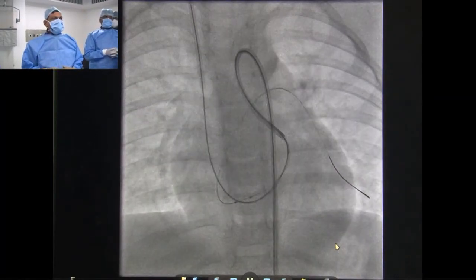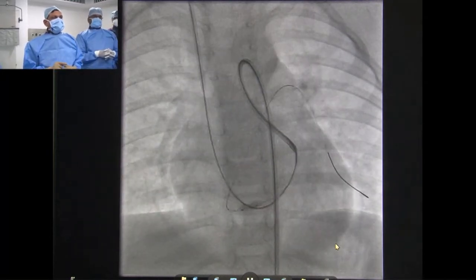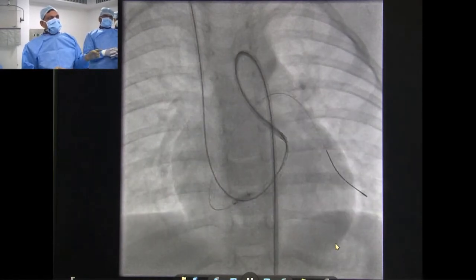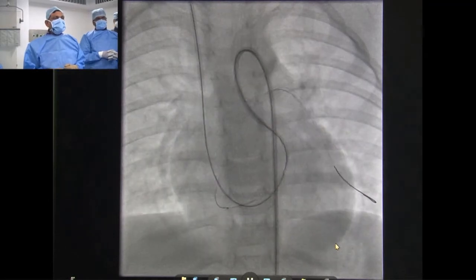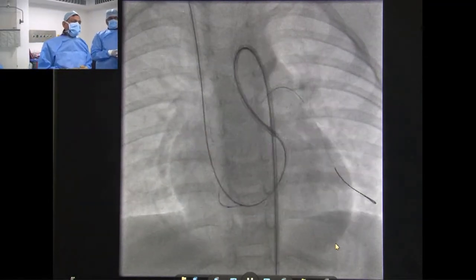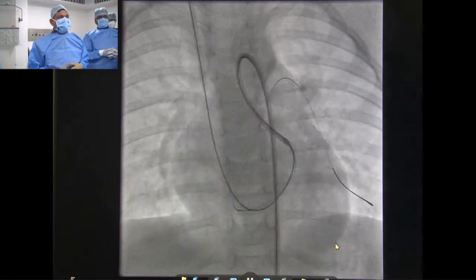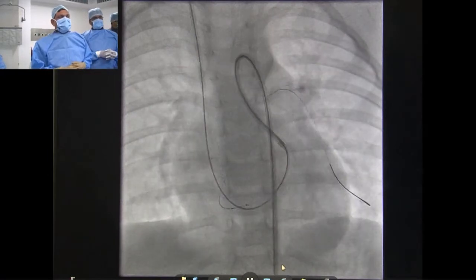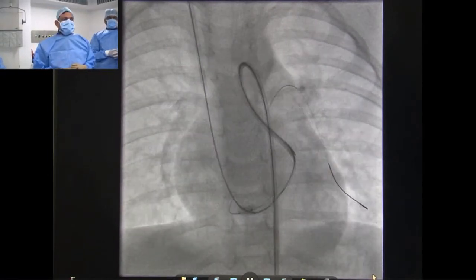So run that. What we have done is we took a 6 guide catheter and advanced it as distal as possible, and we snared the wire so that you get good support without damaging the coronary vascular system. That is the whole idea, not to deploy from the jugular, but you can still deploy from the jugular as well. We put an additional PTCA wire and a 4 into 12 balloon there. This is a coronary balloon.